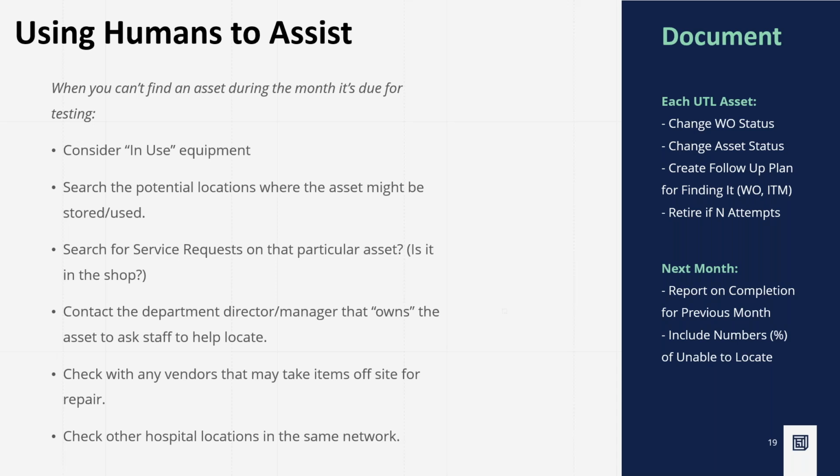And if you're updating that asset information, if you're tracking the department that it's associated with, did that get changed? Could that be part of your inspection, testing, and maintenance? Hey, is this in the department that it said it was going to be in? If not, open up that asset and change the department. Now it is over here. Or do you bring it back to the department? Like, shame on you, slap their hands and take it back to the department that it owned. I have to treat them like children sometimes, I guess.